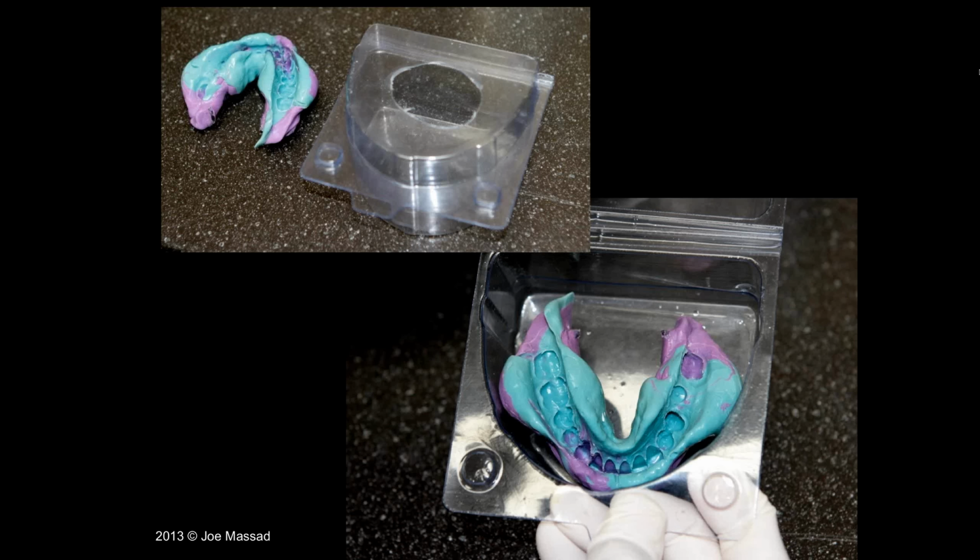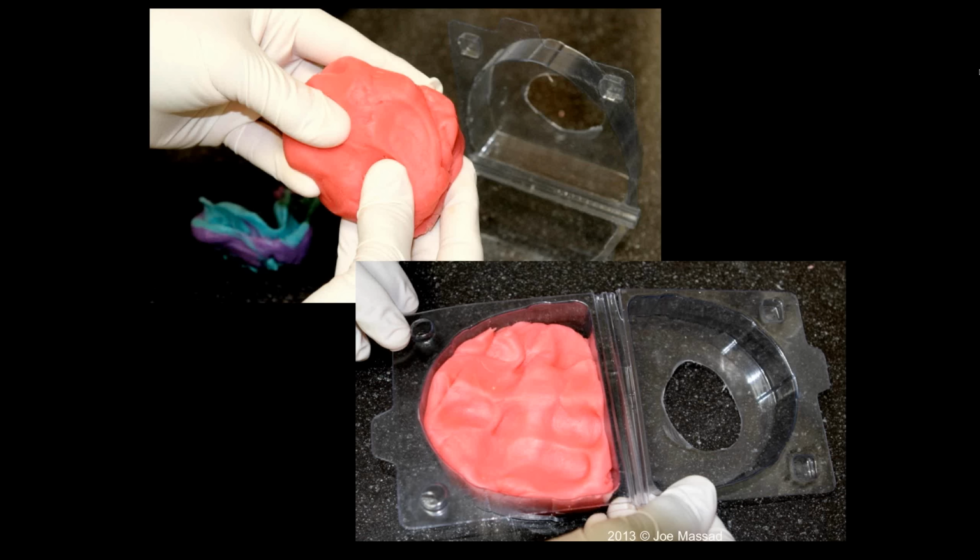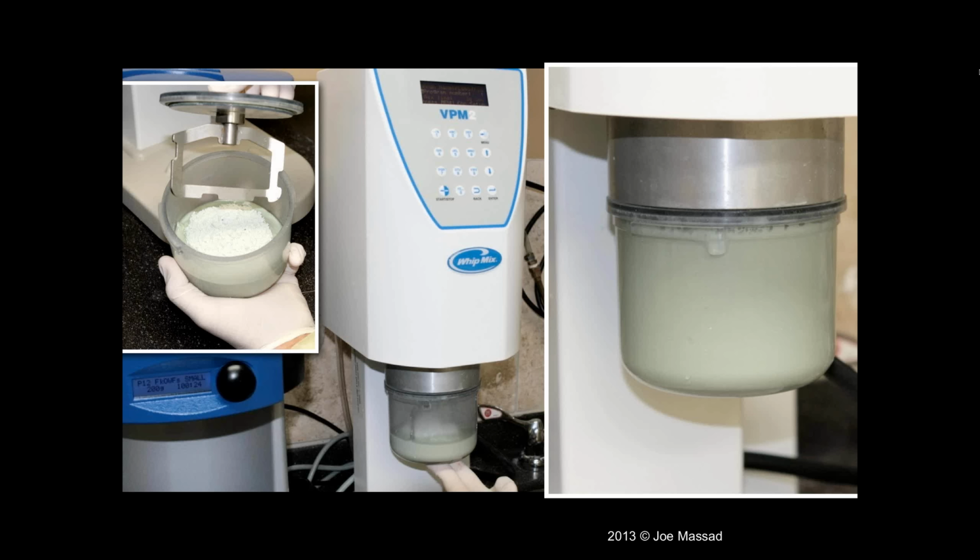Ratio will be dispensed, and then I will mix and extract the air, get a nice fluid mix, and pour.